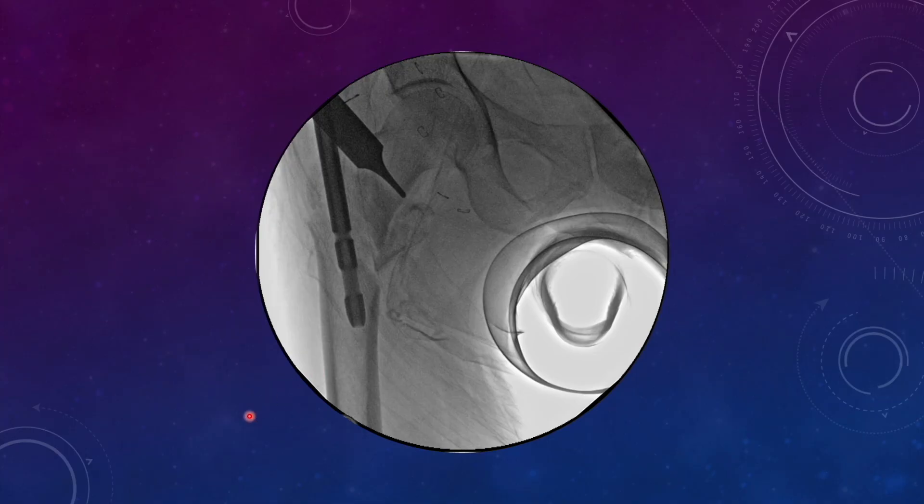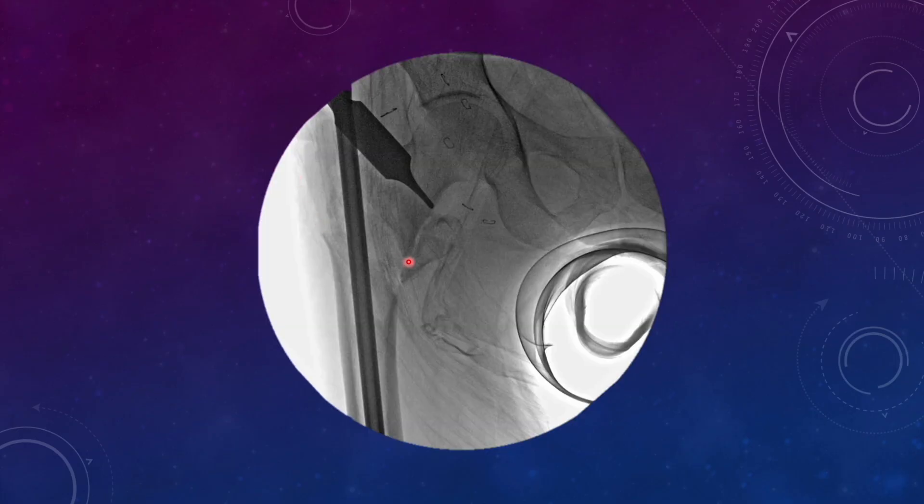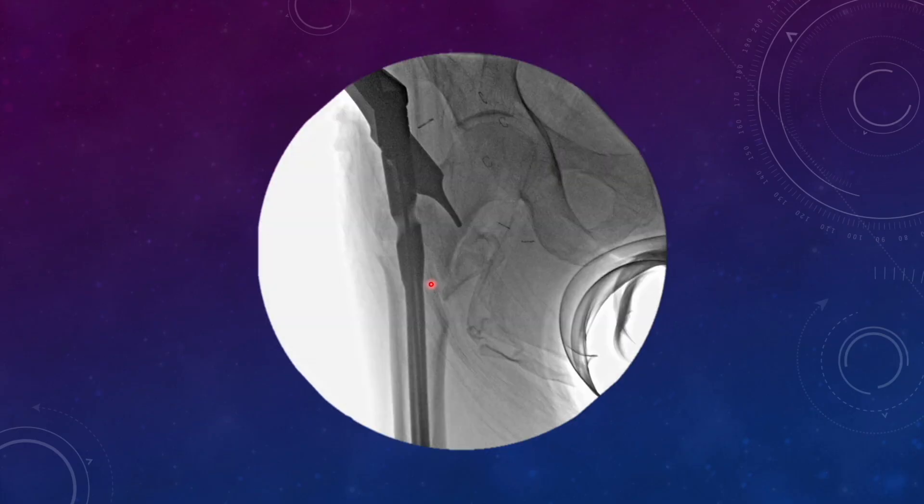When the nail is getting passed, this cortex is becoming slightly negative. Here it appears somewhat aligned, but when the proximal part of the nail is getting inserted, the negative cortex is again obvious. That means the reduction is going negative despite good alignment. You might not say this fracture is in varus, but still the cortex is negative, which is not a good thing.